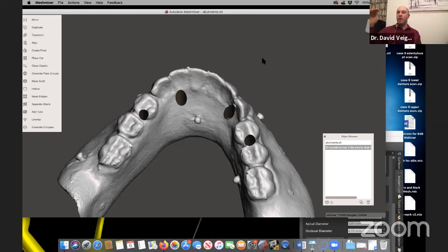And I do it to one of them. I do the same to the other, but I leave one of them with the patient, and I take the other one back to the lab. So they have a physical something that's physically been into the actual patient that's had the modifications to it.